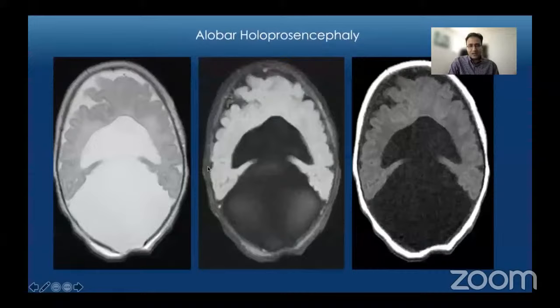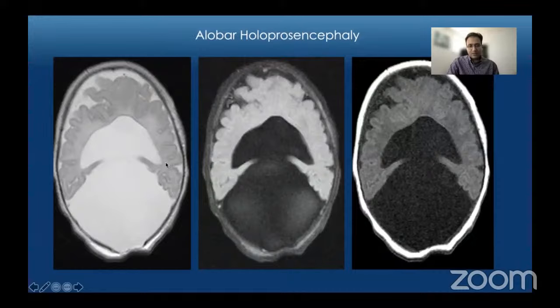This is an example of alobar holoprosencephaly where there is lack of separation of the cerebral hemispheres. There is a single forebrain with a horseshoe-shaped monoventricle which widely communicates with a large dorsal inter-hemispheric cyst.